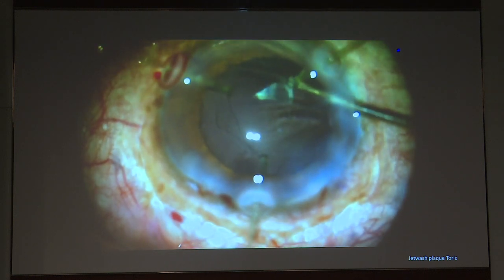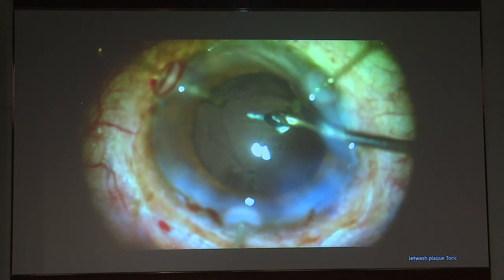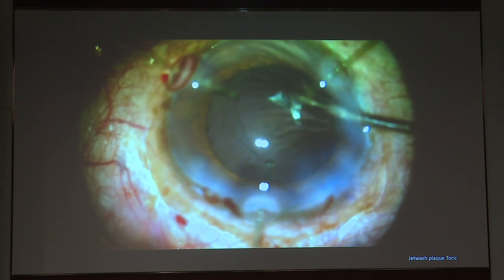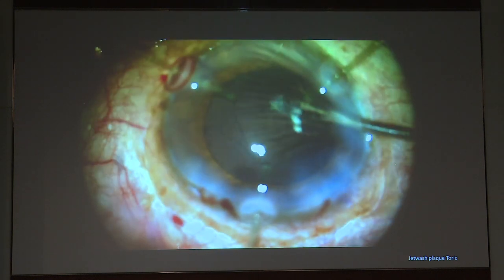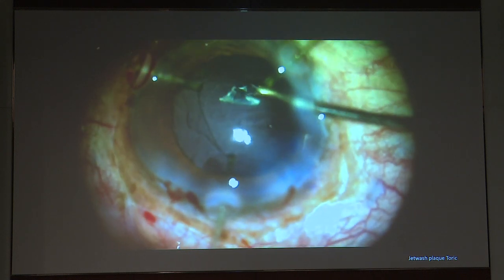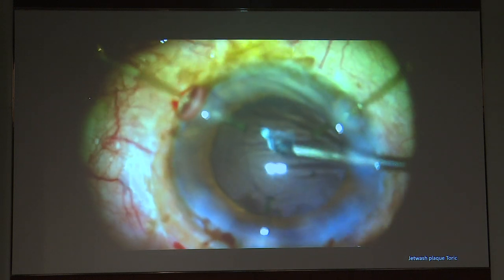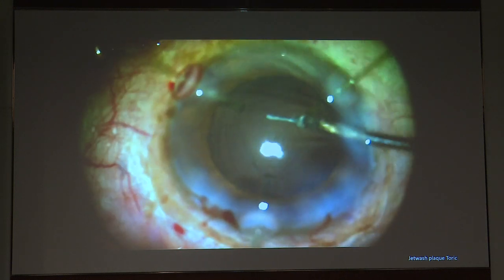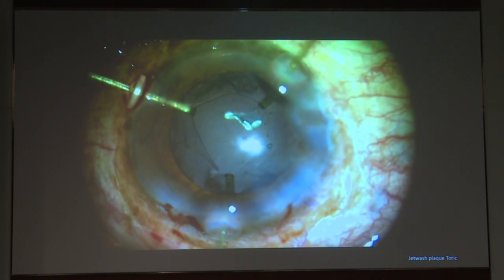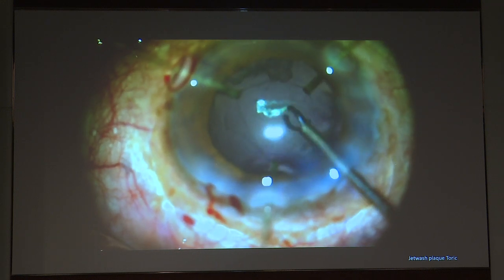So I try to take it off very gently, changing hands and changing forces, making sure that this capsule, as we all understand, is very, very friable and easily breaks. So you have to ensure that you are putting in neither a lot of viscoelastic nor too little. You don't want any kind of damage to the capsule there. So we managed, by pulling in several different directions, and since all this is edited, you can understand that it would have been more painstaking than what is evident here.